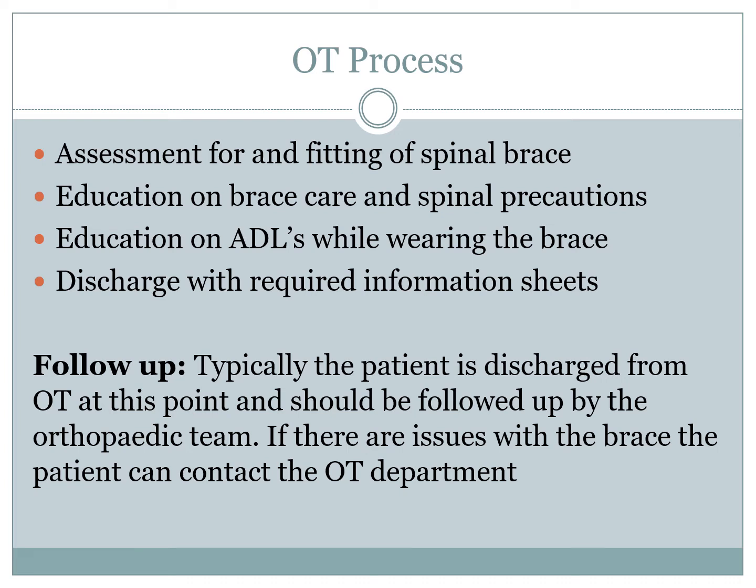If there are issues with the brace, the patient can contact the OT department directly. We aim to have our contact information on the information sheets and also the name of the orthopedic consultant so patients can contact the relevant secretary with any queries.